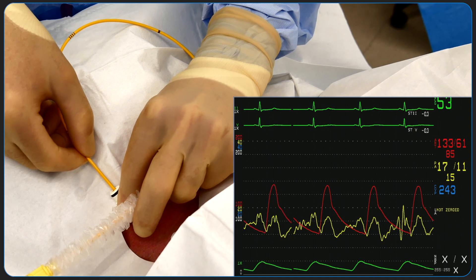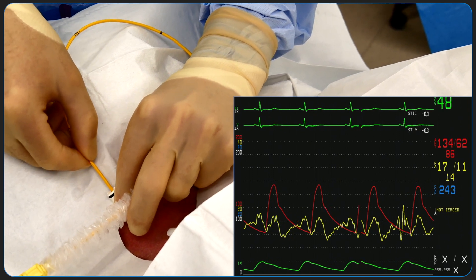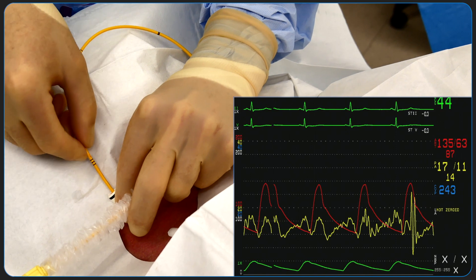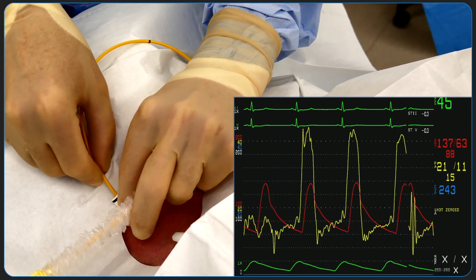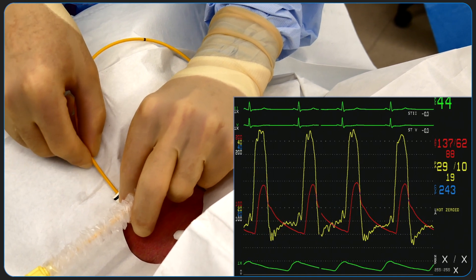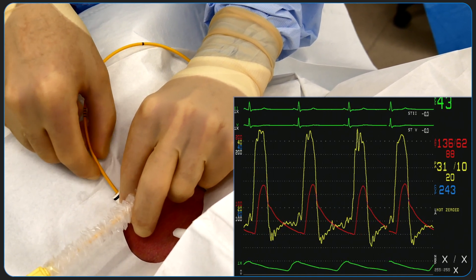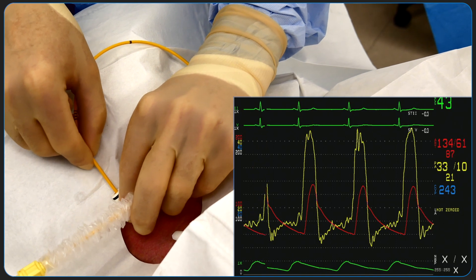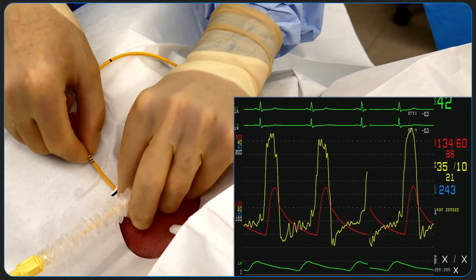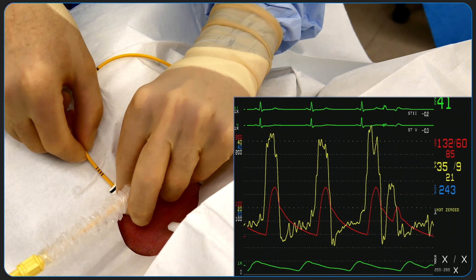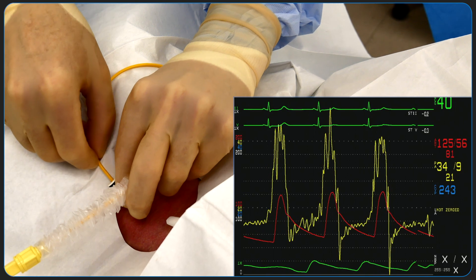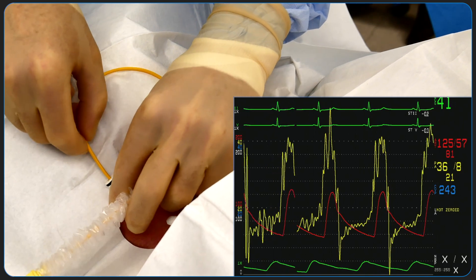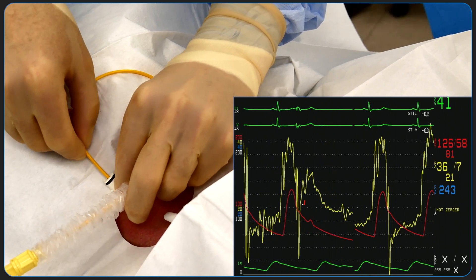The balloon is now inflated and the catheter is advanced with each heartbeat. The transition to a waveform with a steep systolic slope suggests that the catheter has traversed the tricuspid valve into the right ventricle. Insertion of the catheter is periodically paused to emphasize the waveforms for teaching purposes. As the catheter is advanced further, an increase in diastolic pressure, also known as a diastolic step-up, is seen. This suggests that the tip of the catheter is now in the pulmonary artery.